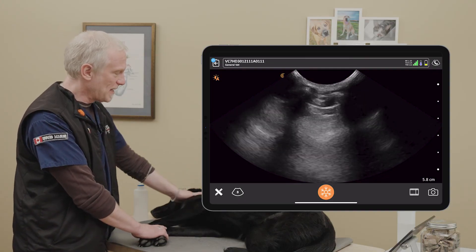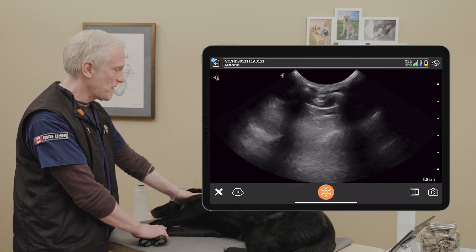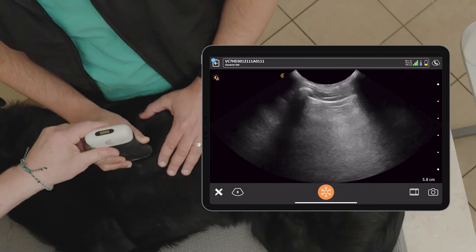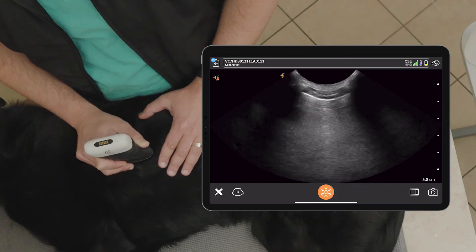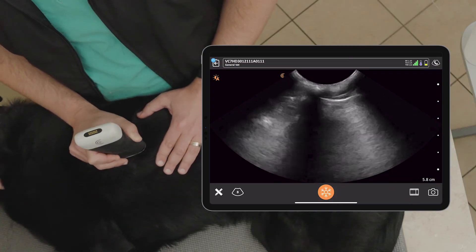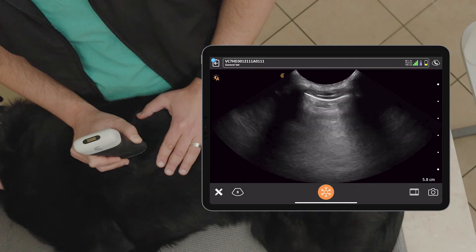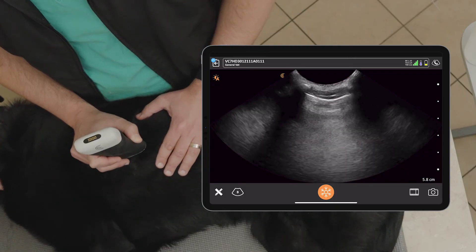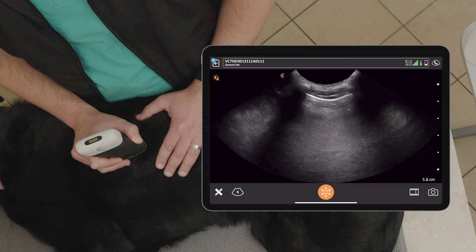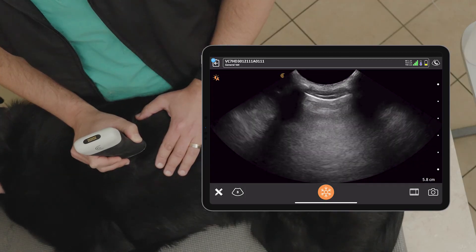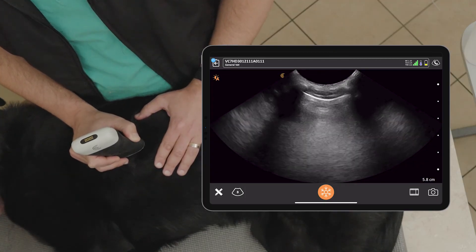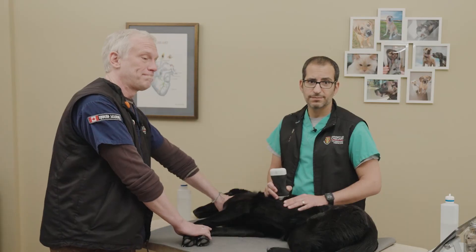As we said, if the patient is in a lateral position as Penny is here, we're just going to pick that widest spot and look for lung sliding at that highest spot. We'll also look at that curtain sign with them in lateral and explore it for abnormalities suggestive of pneumothorax. Excellent.